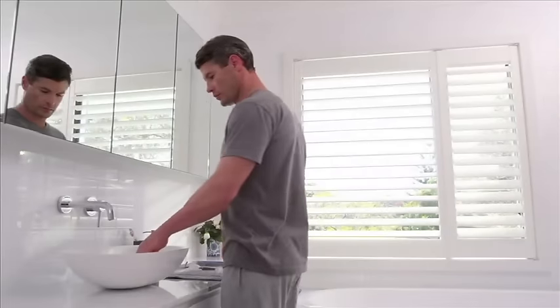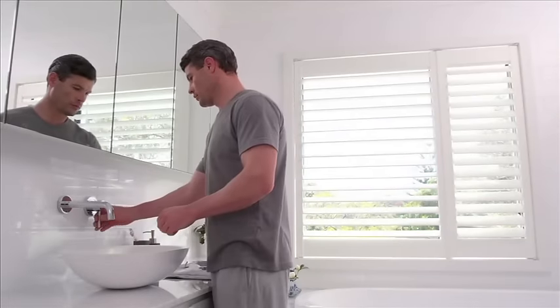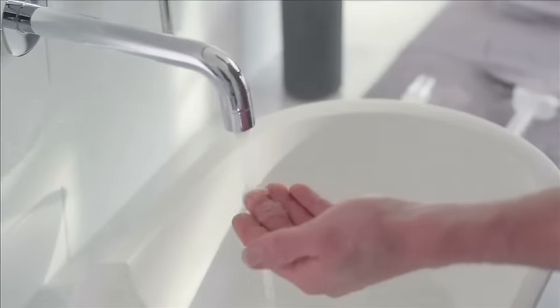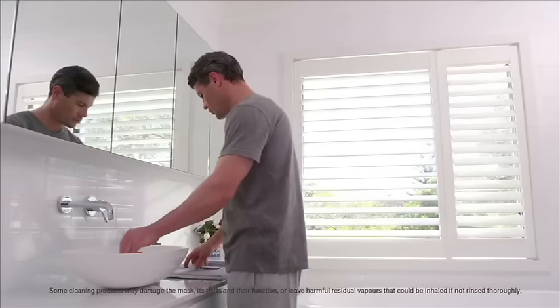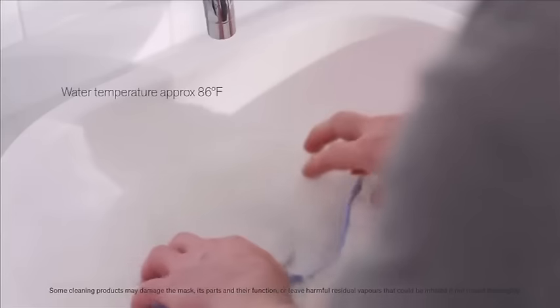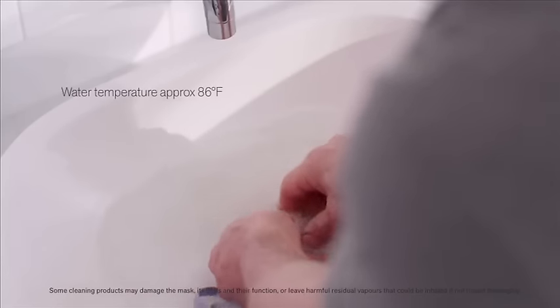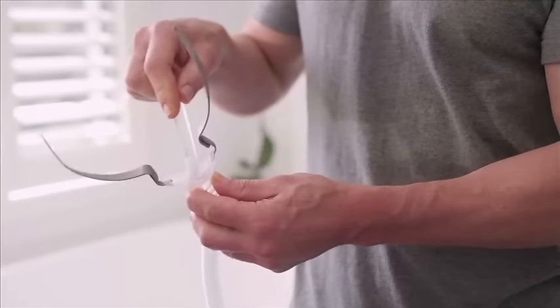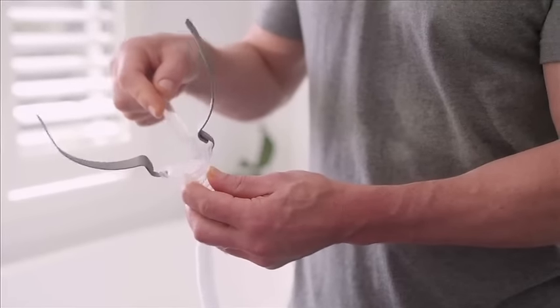Always follow cleaning instructions to maintain the performance and safety of your mask. Hand wash the pillows and frame with tubing daily by rubbing in warm, soapy water using mild soap. To keep the vent clean, use a soft, bristled brush daily.